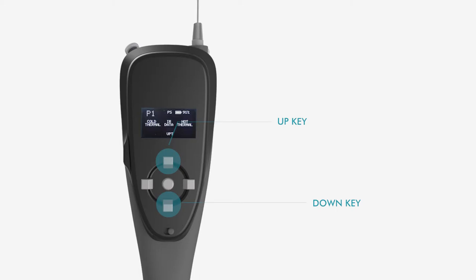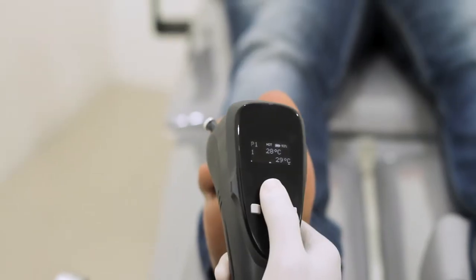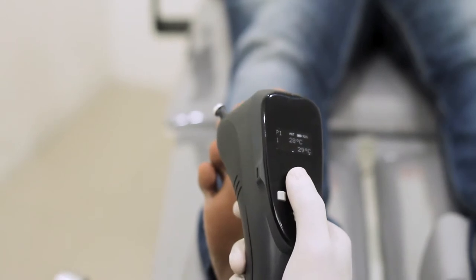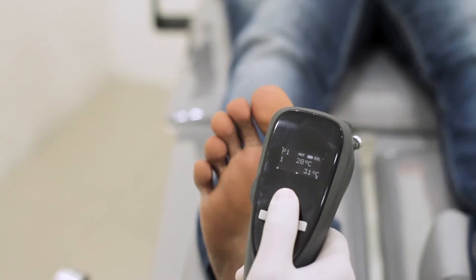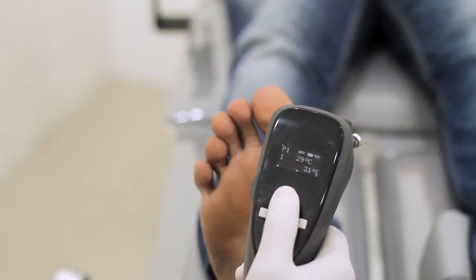Long pressing the up or down key scrolls up or down faster. Please wait till the actual probe temperature is equal to the set temperature before using. Blinking actual probe temperature indicates to wait.